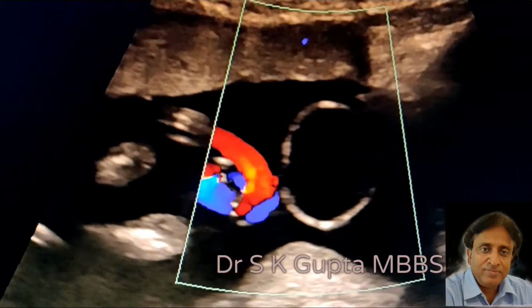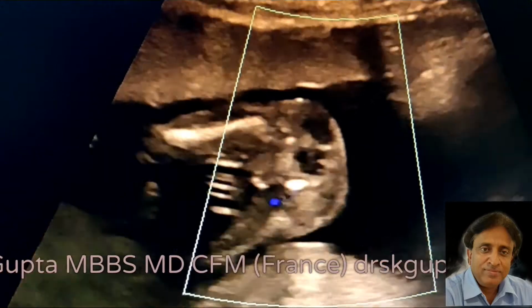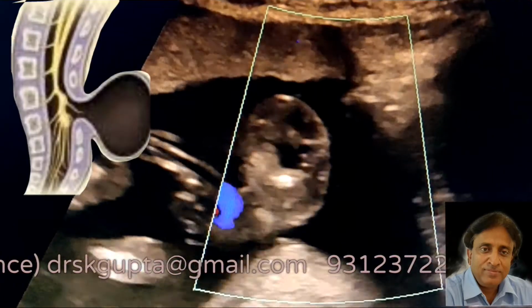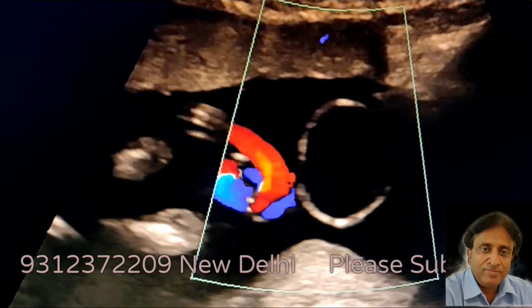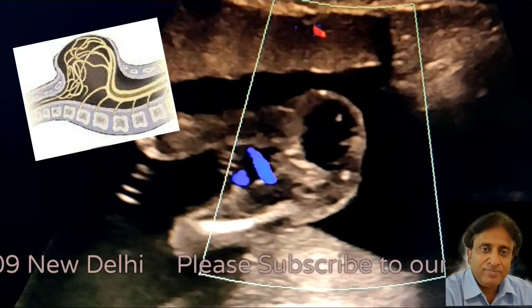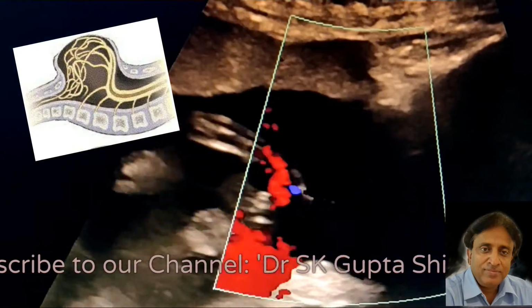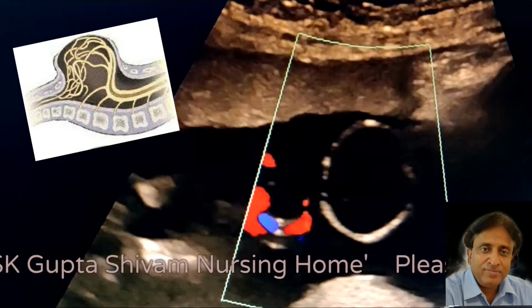Meningocoels are basically a defect in the spine through which the meninges start protruding into the skin and form a cystic swelling, and in case the nerve roots and the spinal cord also start protruding along with the meninges, then it is called a meningomyelocele, and in case only the meninges are protruding, then it is called a meningocoel.